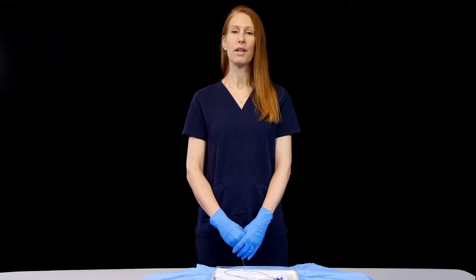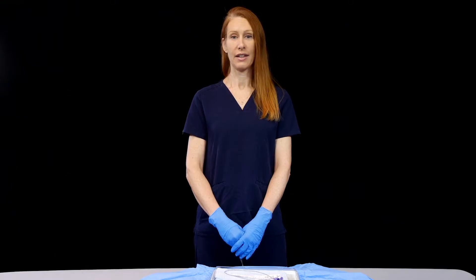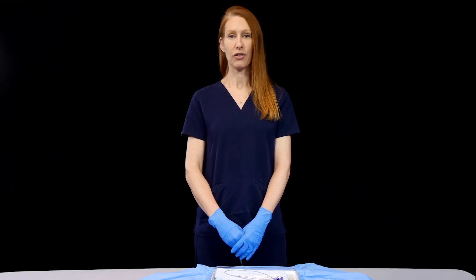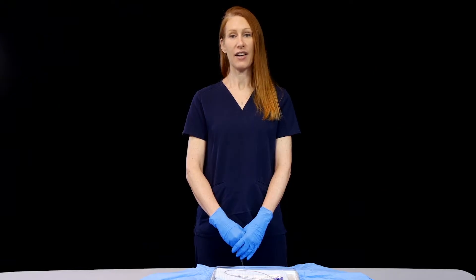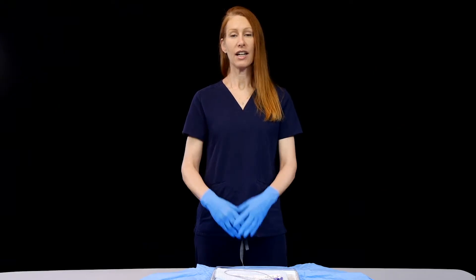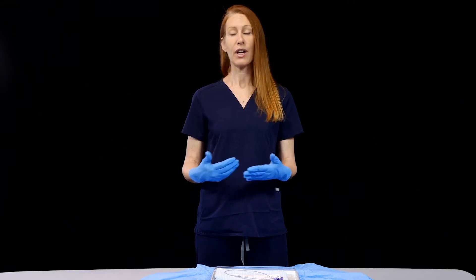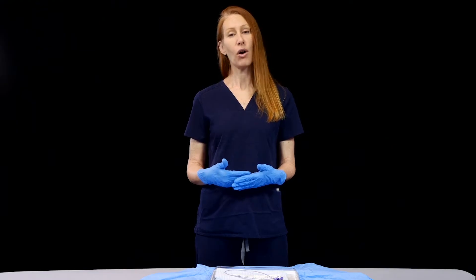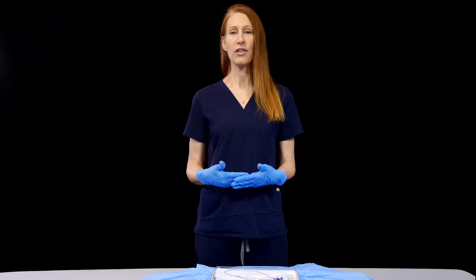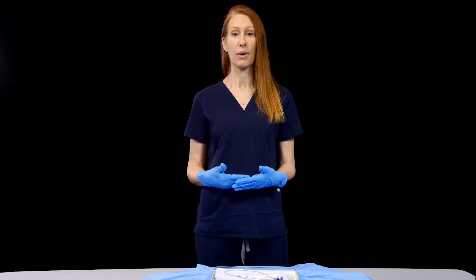I'm Eileen Claudius, and I'm going to be going through the emergency umbilical venous line. This is a great procedure for access in kids typically under 10 days of age, especially a child who was born in the emergency department. Sometimes you're lucky enough to get an IV in these kids, and we can always use an I.O., but I.O.'s tend to blow very frequently in these younger kids, so if you can get an umbilical venous line, that is great.